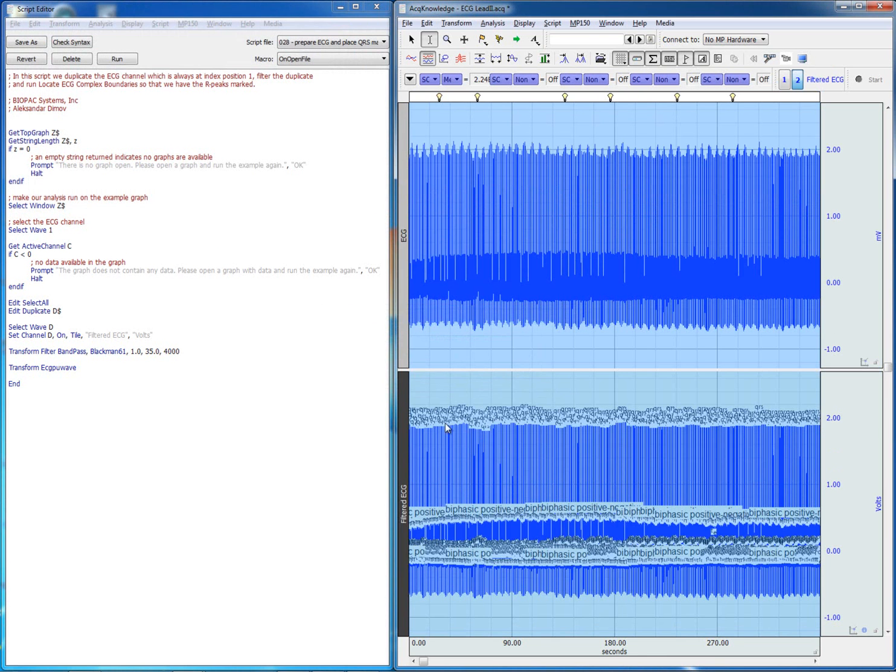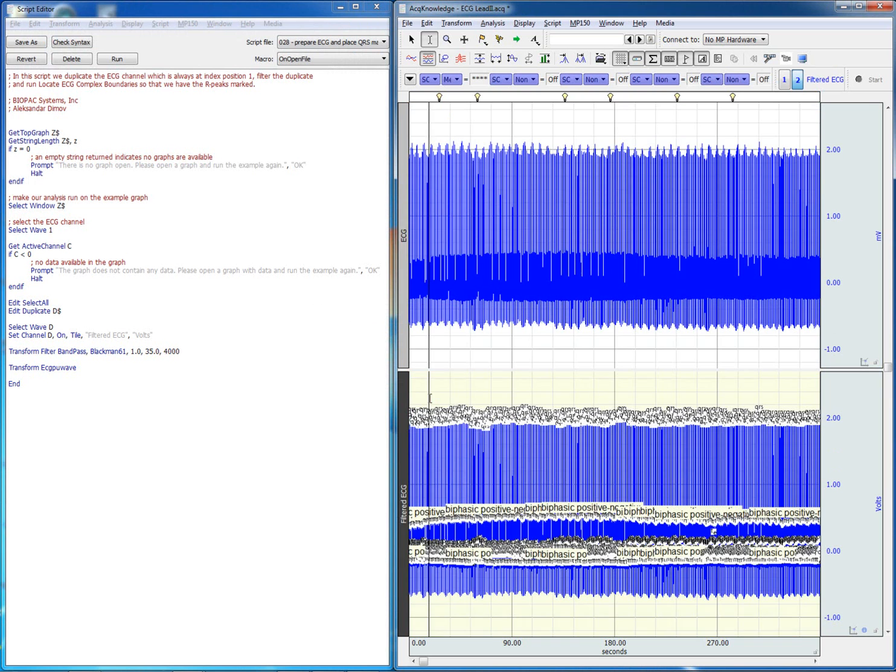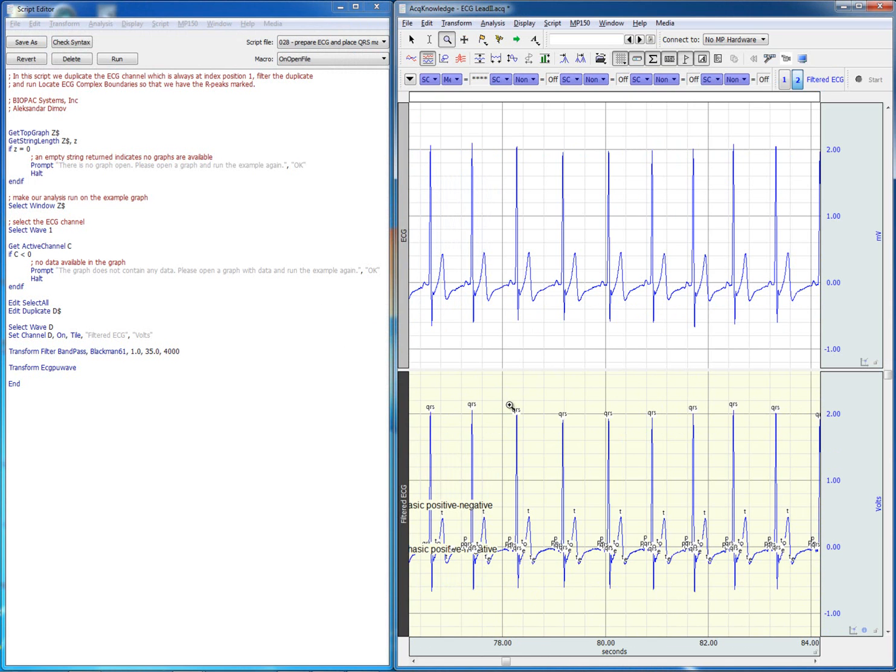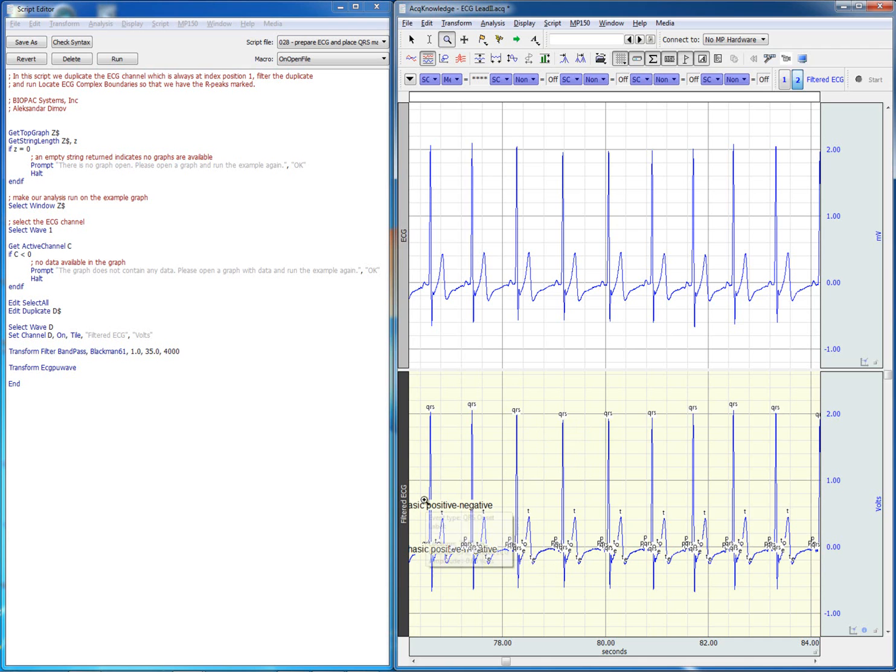So the result is now placed in the channel just below. It is a whole lot of information as you can see we have not just the QRS marker which would be sufficient to give us heart rate but we have all the other markers associated with the heart cycle.